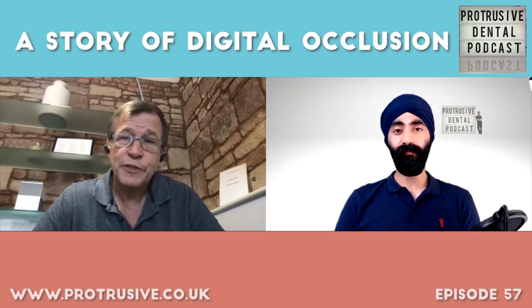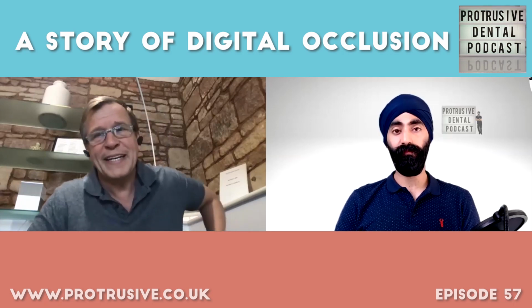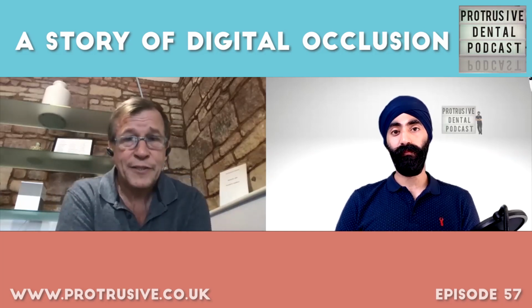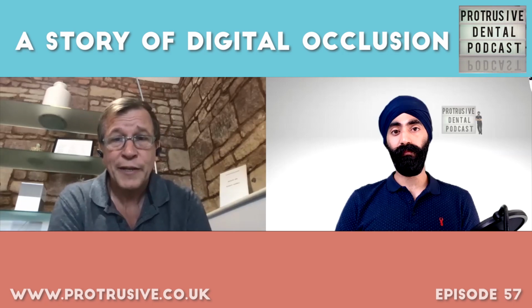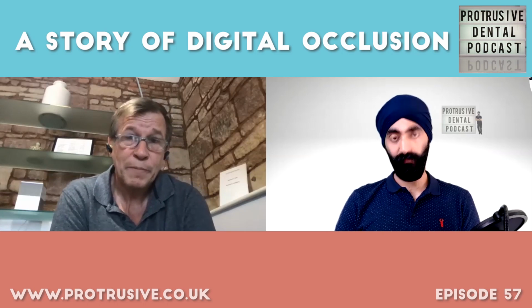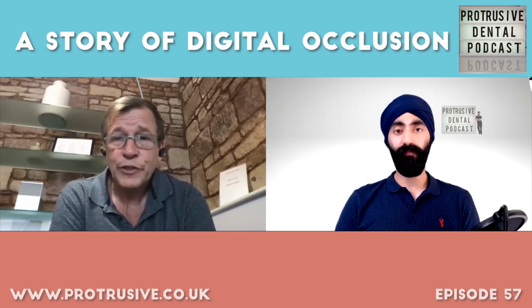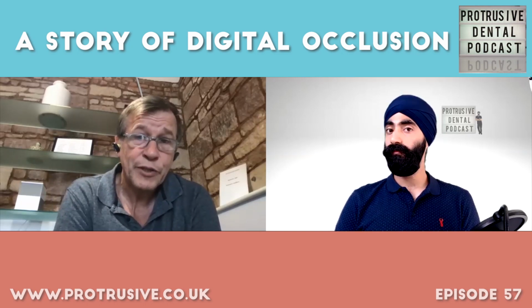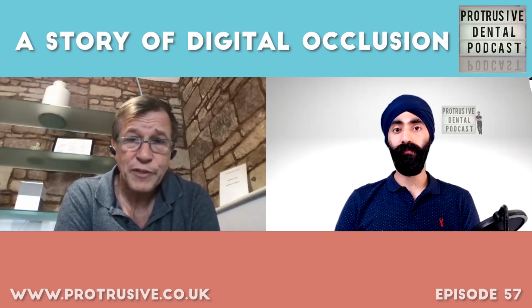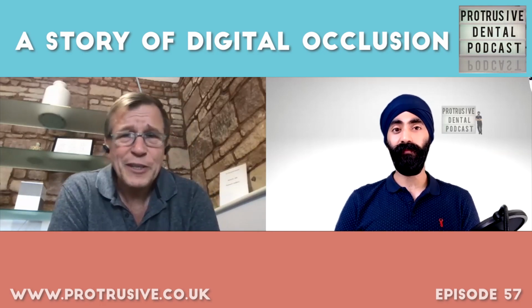And a lot of it was based around single tooth dentistry, so it was really more about in-house milling than anything else. And so over time, and as I got my own practices, then I came to a point where, again, standard was important to me. So it was important that we could make good restorations. But I was doing a lot of inlays, onlays, and posterior crowns, which I thought I could do very nicely with digital. So we became very, very efficient just with in-house milling of single posterior restorations. And occasionally we'd fool around with anterior stuff, and it was a lot more challenging.